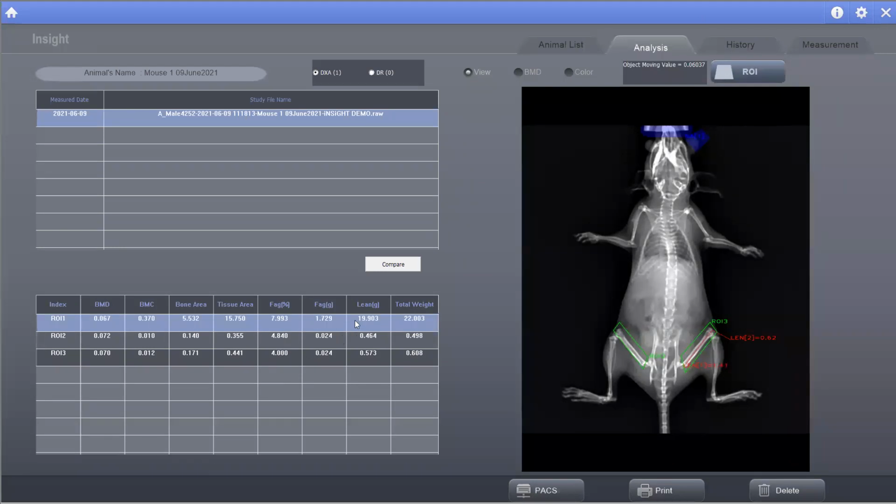Okay, exporting the data is quite simple. You can take the data and export it as an image or the data itself. By doing Control-Shift-E, I can export again as CSV or text, and that will be able to be opened in Excel as an example. And if I do Control-Shift-I, the images are going to come out in various formats as well.